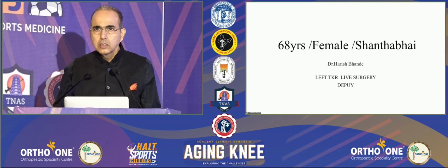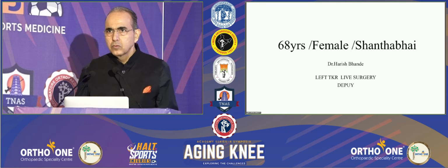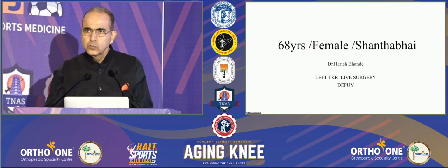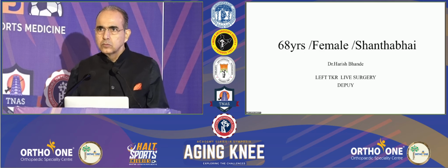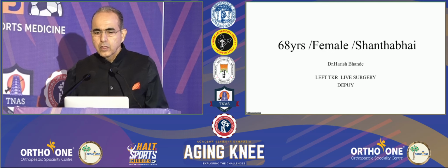Sorry? This is perfectly fine in patients where there is a significant varus without much posterolateral laxity. In case there is significant laxity, maybe requiring a semi-constrained backup, something of that kind for a lax knee.